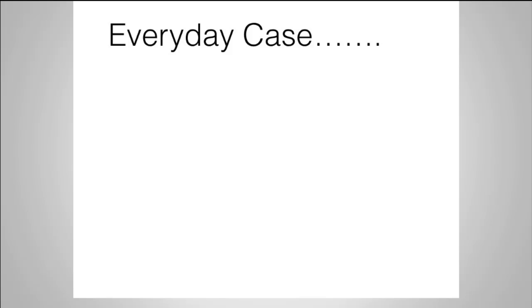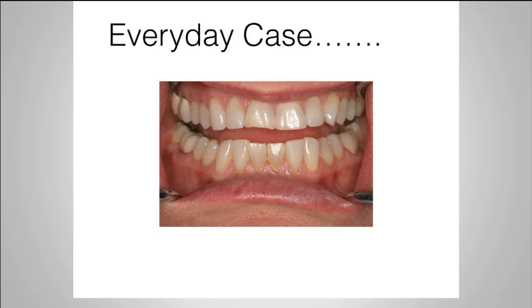So, looking at a couple of the Harmonize cases that I've done over the last few days, and none of it's earth-shattering. I don't mean to think that I'm the best dentist out there, by no means, but what I'm trying to show you are things that we do on an everyday basis. This is a particular case where a lady came in, chipped off an older filling on her front tooth, and was going to dinner, an important dinner with a business colleague, and she wanted to have that fixed relatively quickly.